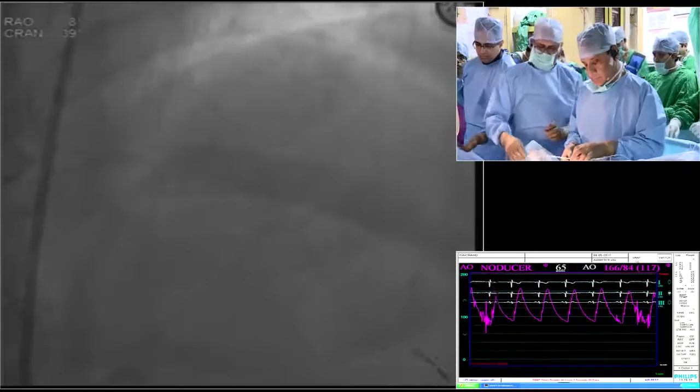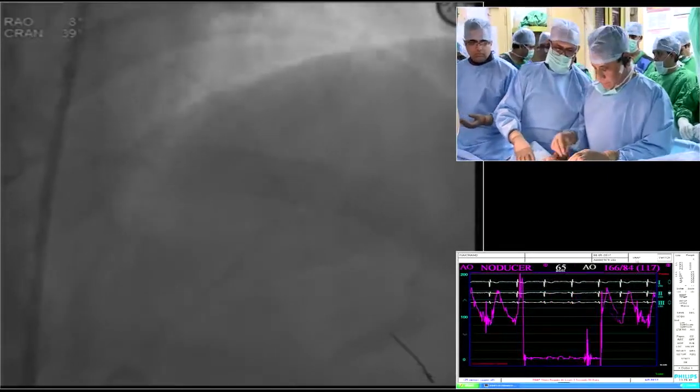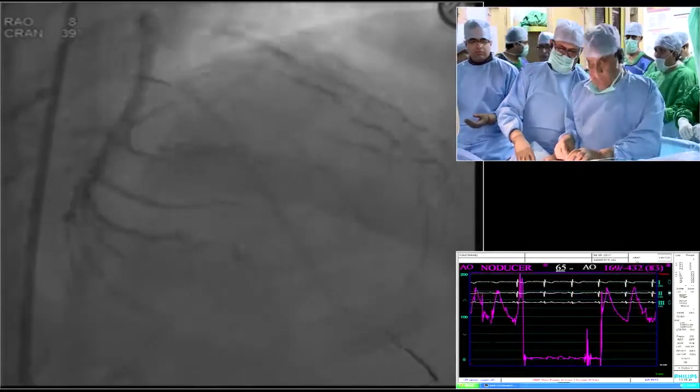All patients we had done a follow-up, 20 patients, with OCT and 1 year follow-up. And the data is very promising. Very promising. And no scaffold thrombosis. No scaffold thrombosis. Yeah, that is the biggest concern.